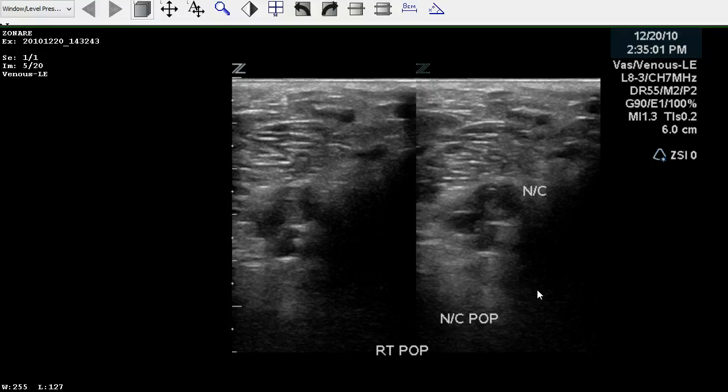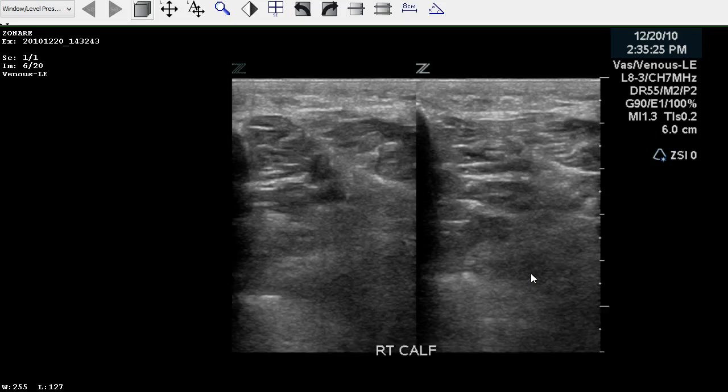We get to the popliteal, and we see that there's echogenic material within the vein here and here. The sonographer has put an NC next to it to let us know that there's non-compressibility of this vein. As we continue further into the calf, we can assume that there's full compressibility within the calf veins.